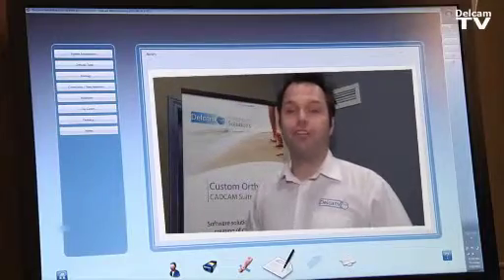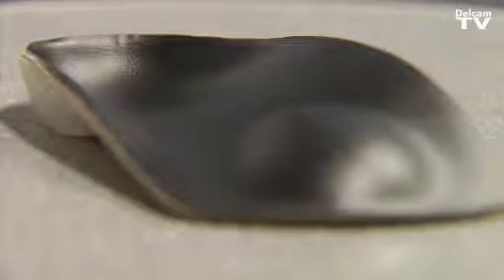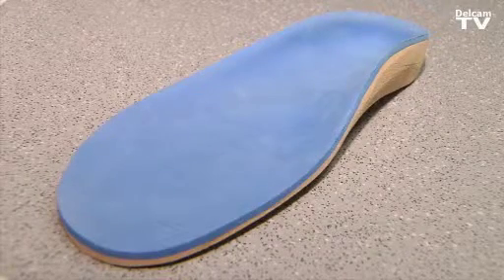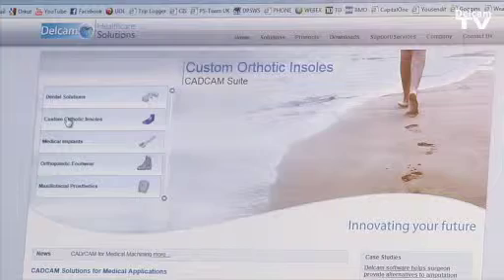The next step uses OrthoManager, where the practitioner or doctor can send all this information to the lab — including the 3D shape of the patient's foot, the picture, and the prescription. No longer do we have to mail a crush box or casts; everything is sent by email and the lab can automatically start manufacturing the orthotic. For more information about our healthcare products, please visit www.delcam-healthcare.com.